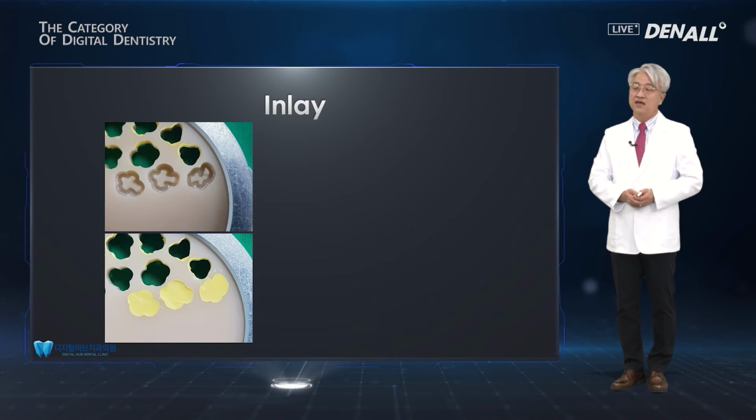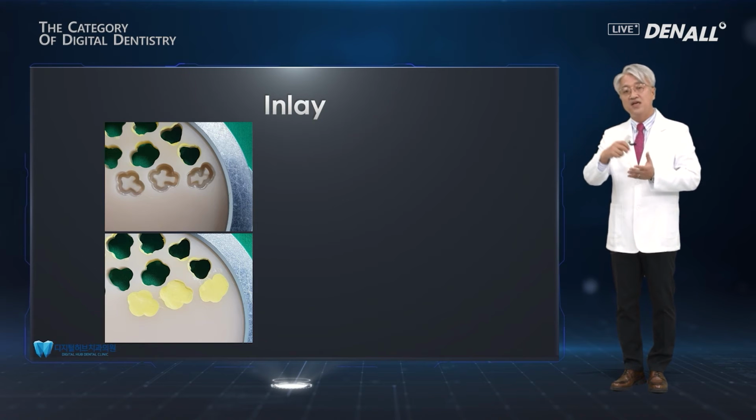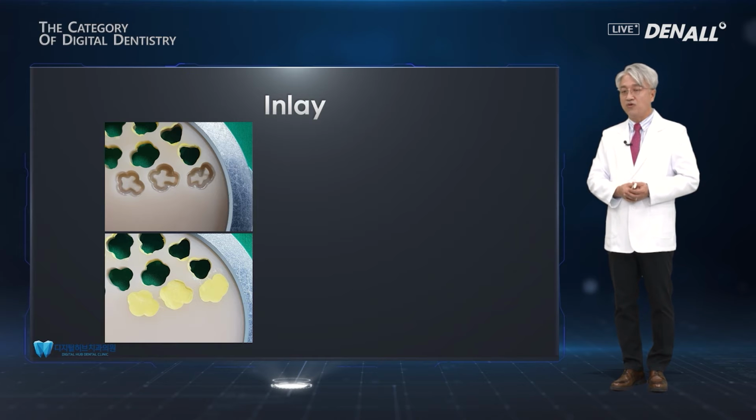So this is the submerged approach that I use. After designing the inlay and milling the inlay material, if it's a crown, then using a supporter, you can fix it in place. But an inlay is small, and for the contact and occlusal surface, if you use that type of connector, then adapting to the patient could require a lot more time, and it could actually distort the occlusion.